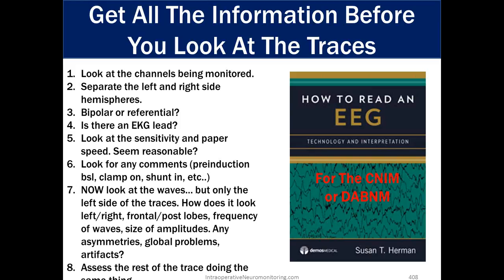Then you're going to look at the pattern of the montage. Are we looking at a bipolar or referential? If we're looking at bipolar, do we see anything that has any kind of phase inversion, like we would see in some kind of seizure pattern? If we're seeing referential, do we see any amplification of amplitude that's similar in different channels being referenced to each other differently, but it's present in each pattern?